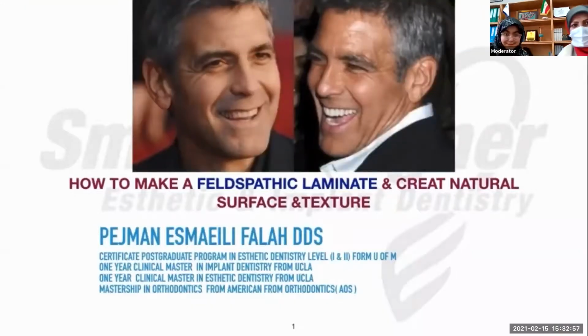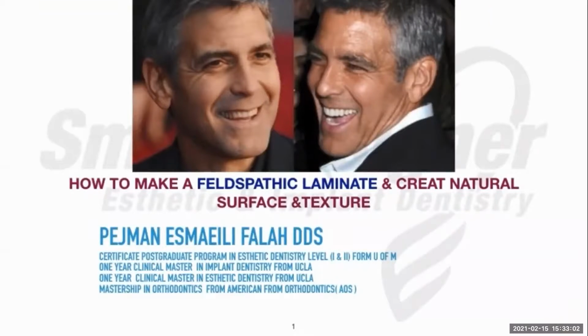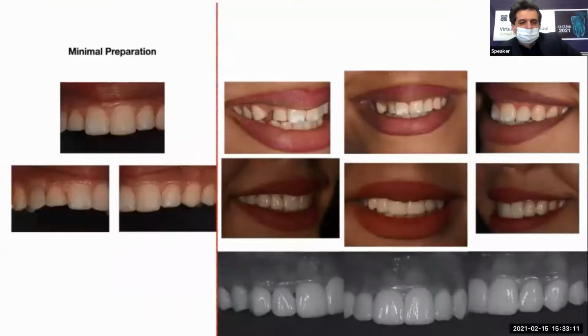Hello, everybody. I hope you are doing well. In this lecture, I am talking about how to make feldspathic laminate veneer in the lab and how to create surface structure on porcelain. In this case, firstly, I placed an implant and then made feldspathic laminate veneer for anterior teeth. Due to lack of time, I cannot present the procedures of treatment.